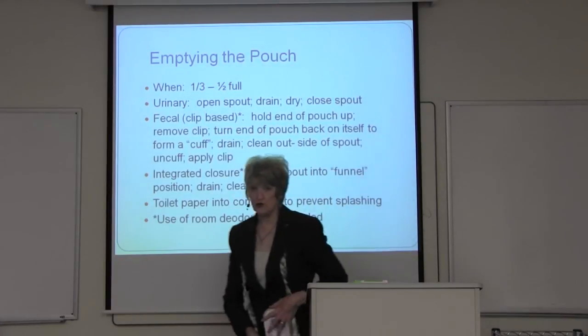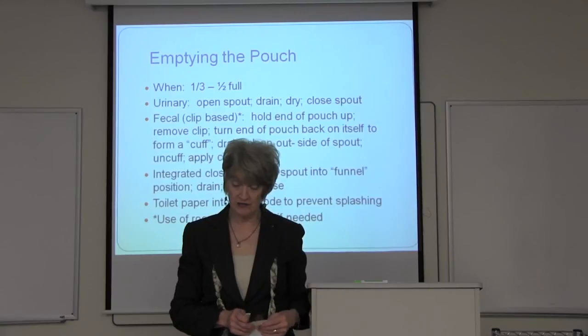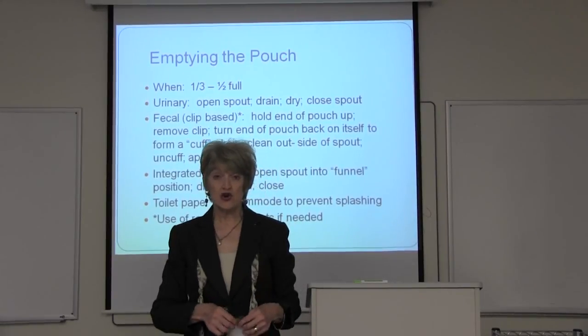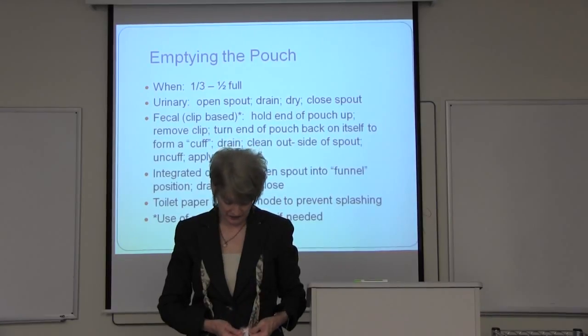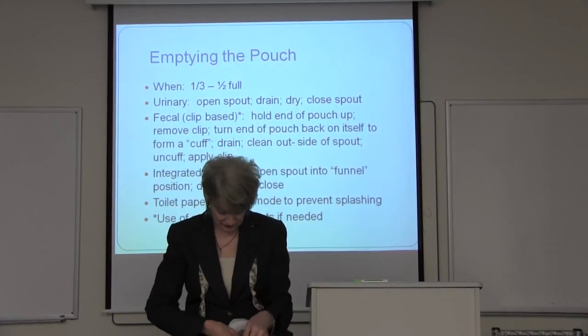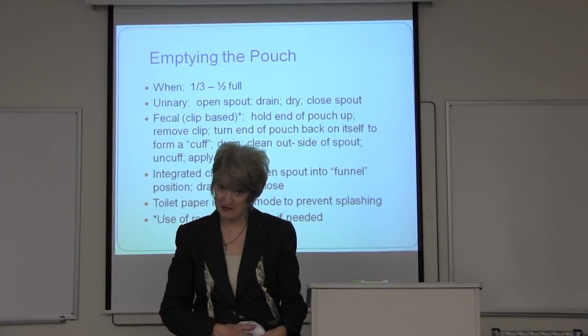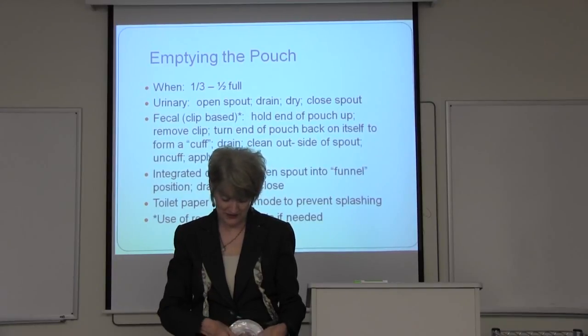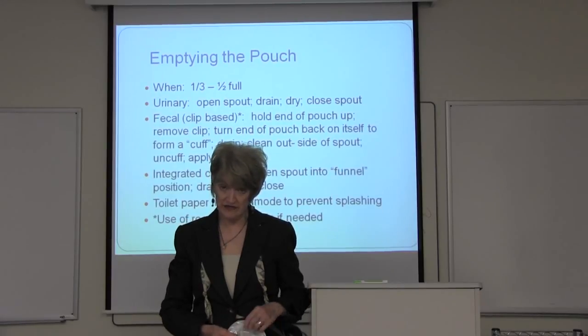So I'm going to come over here. You want to teach them to hold the pouch up, take the clip off, and turn the end of the pouch back so that it forms a cuff. Oops, my pouch came off. That's bad. Then I guess I wouldn't have to drain it because it'd be draining all over the place. So turn it back on itself so that it forms a cuff.